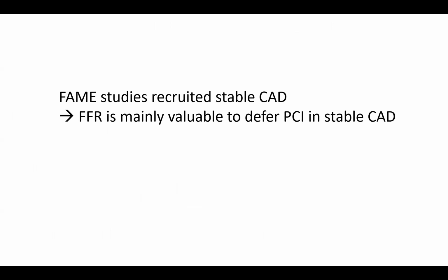Importantly, FAME studies 1, 2, and 3 recruited stable CAD. So FFR is mainly valuable to defer PCI in stable CAD. I will comment on the applications in MI later on.